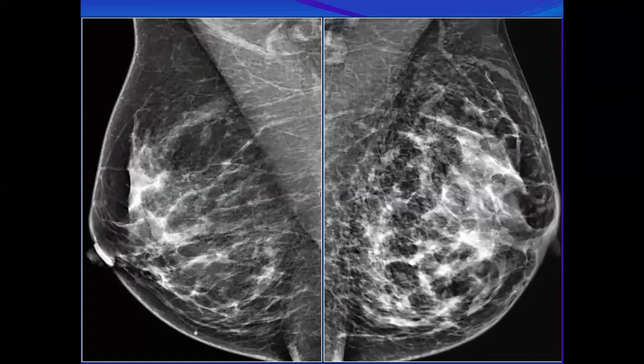There is an area of global asymmetry affecting the left breast. It is associated with skin thickening and trabeculations, a thickening of the trabeculae. And the nipple, even the nipple, I think it's somewhat thickened. But the skin thickening and trabeculation are obvious.